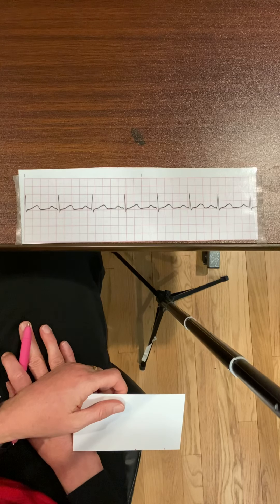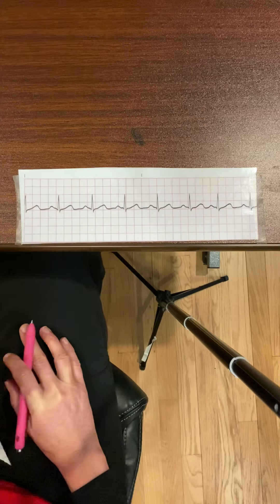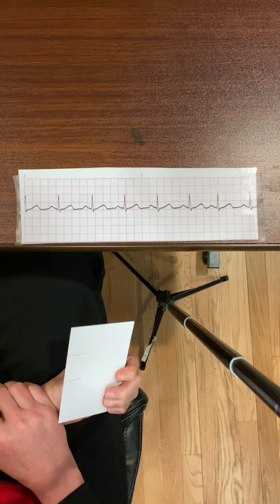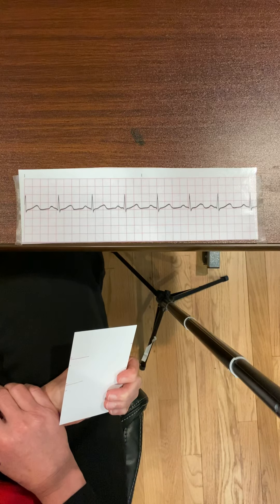The next thing I need to do is analyze my P waves. I look at all the P waves and check if they're upright, smooth, rounded, and consistent — I want to make sure all my P waves look the same throughout the rhythm strip. They do: they're all upright. Most importantly, every P wave precedes a QRS, so I'm happy with my P waves.